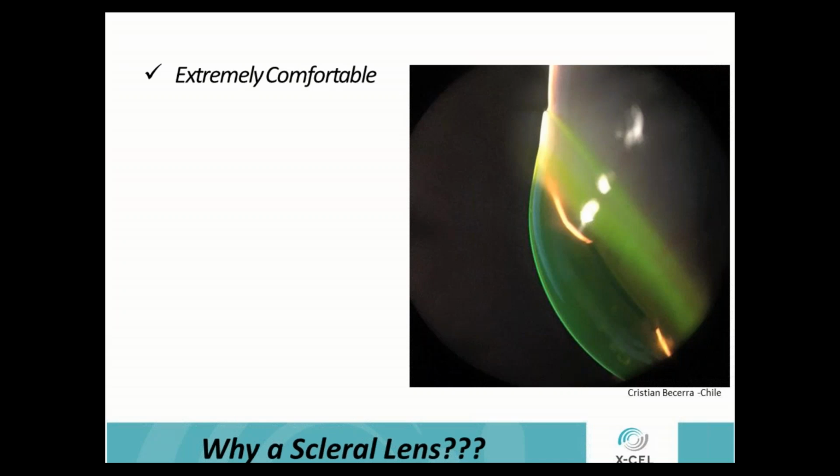So if you haven't fit Sclerals and you're wondering about these advantages, they started out, again, really becoming popular 8 to 10 years ago. MD/OD practices mostly, where they're seeing a lot of challenged corneas, and they started out really mostly with diseased corneas, corneal ectasias, cone patients specifically. And once we started to fit these patients, we started to see all these advantages of a scleral lens. So when you're comparing a GP scleral lens to a corneal lens, we found out all these benefits. Scleral lenses are extremely comfortable when they're well fit.